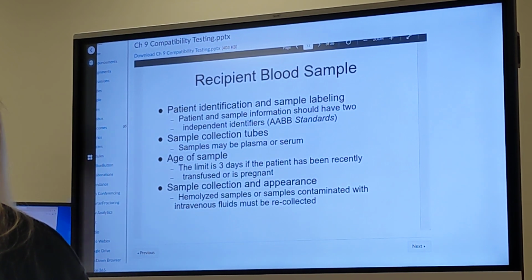It's terrible. Now, almost everything is barcoded. And so you'll go in the room, you have a printer and a scanner, and you'll scan the patient's armband, and the orders have already been placed in the computer, and the labels that you need are going to print out, and they're stickers, and you just slap a sticker on there. It's amazing. So that's how it usually is now.